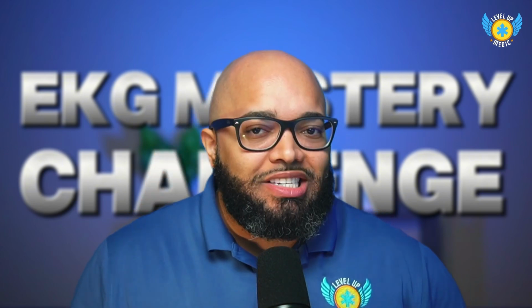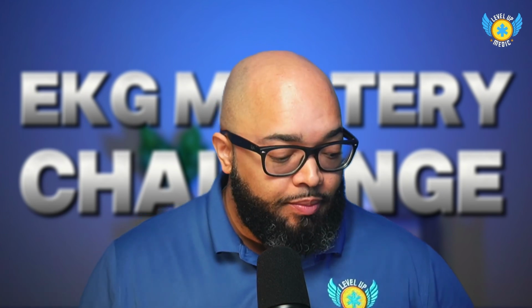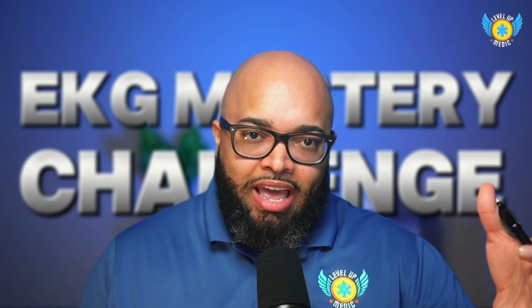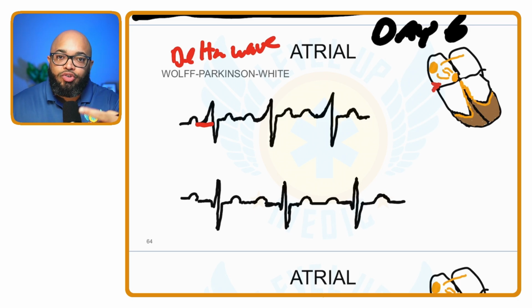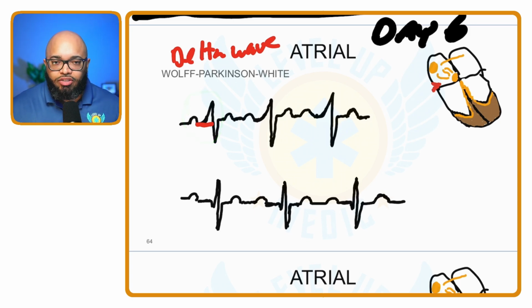So a way you would say that is it's a shortened PR interval. Because it's happening faster, the time from the P wave to the R wave gets closer together. So we call that a shortened PR interval. What you notice with Wolff-Parkinson-White is you're going to have this characteristic delta wave, that upsloping wave right after the P wave, and a shortened PR interval.